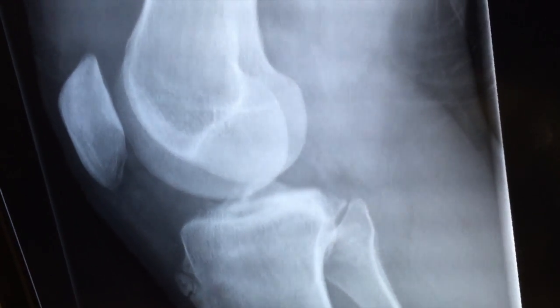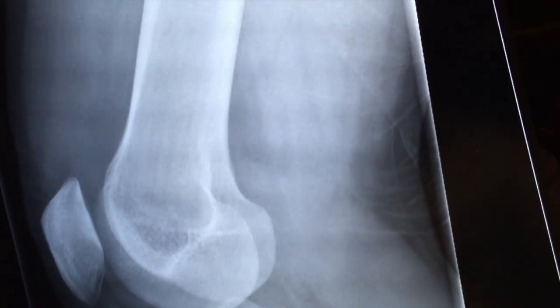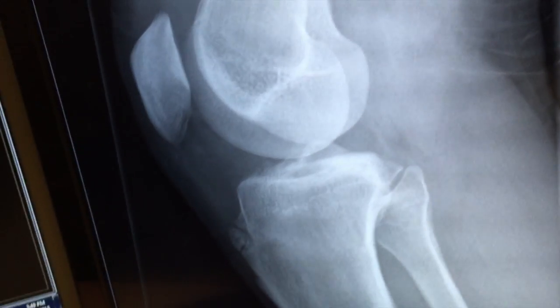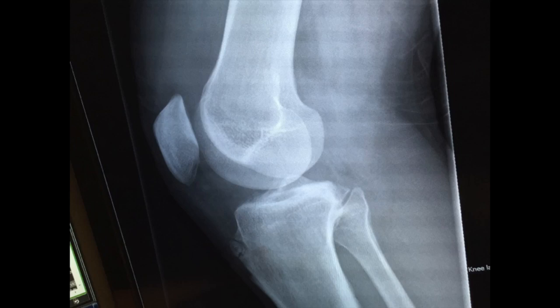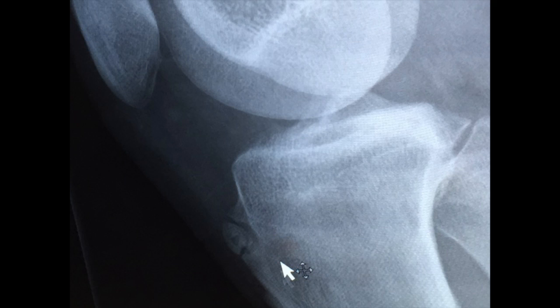This was a case of a 28-year-old male with right knee pain, and an X-ray was requested. The X-ray shows fragmentation of the tibial tubercle, consistent with Osgood-Schlatter disease. It is associated with chronic fatigue injury with repetitive microtrauma involving the patellar ligament, which is inserted into the tibial tuberosity.